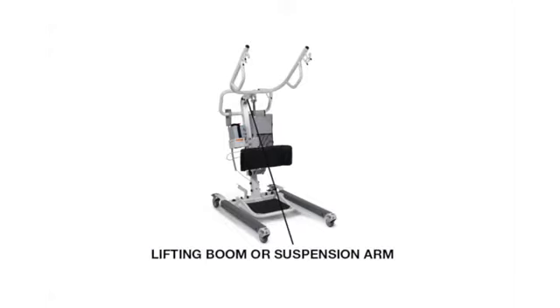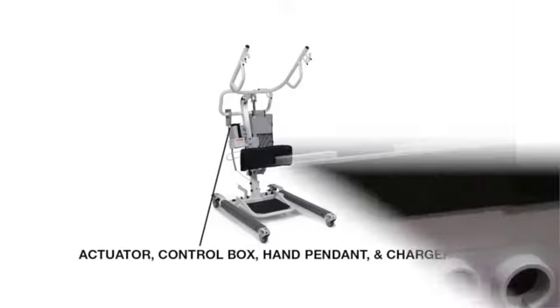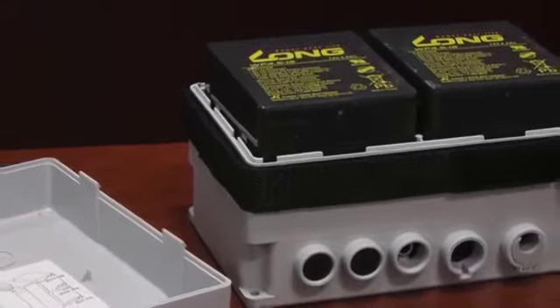The lift is constructed of heavy gauge steel. Let's review the parts of your lift: base, mast, lifting boom or suspension arm, padded knee pad, non-slip foot rest or platform, push bar, actuator, control box, hand pendant, and charger.